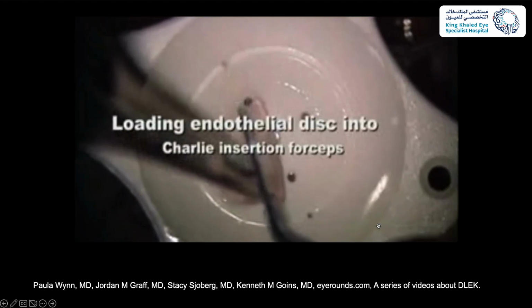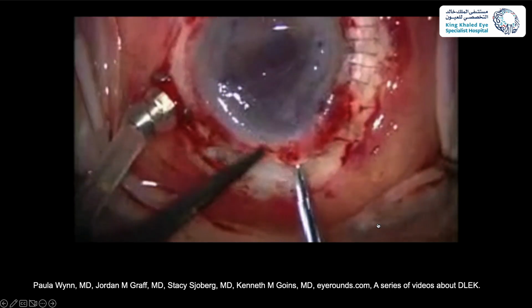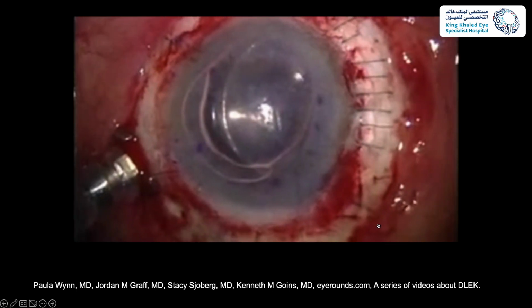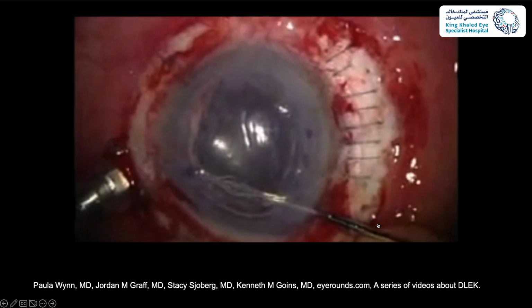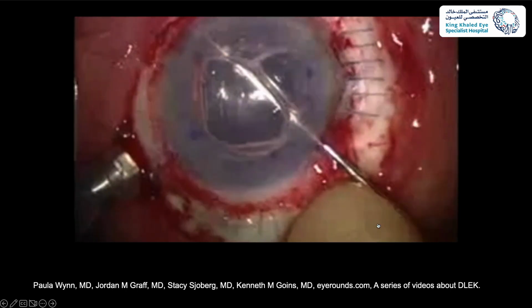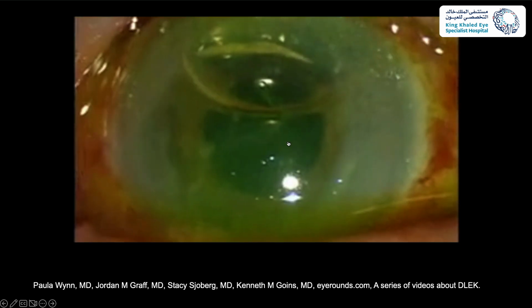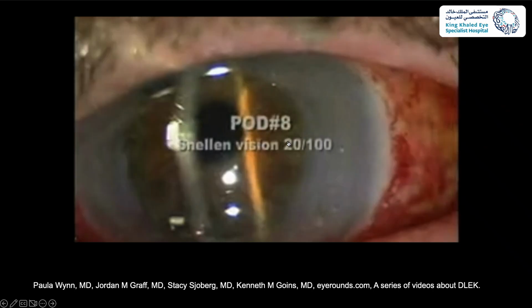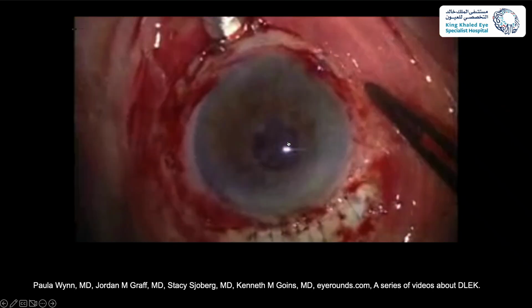You can tell from the technique that this is an old technique. I guess nobody's doing the folding of the DSEK graft nowadays. Readjusting of the graft. It is doing something that I'm not sure what it is. So this is post-op day 1. This is post-op day 8, and the vision is 2/200.